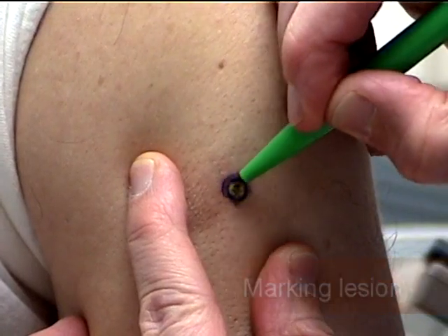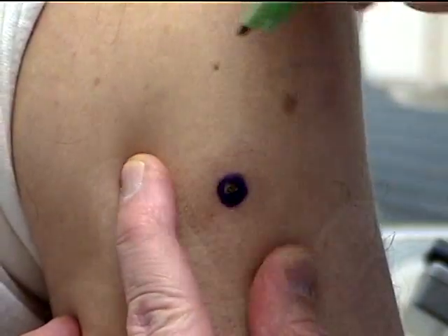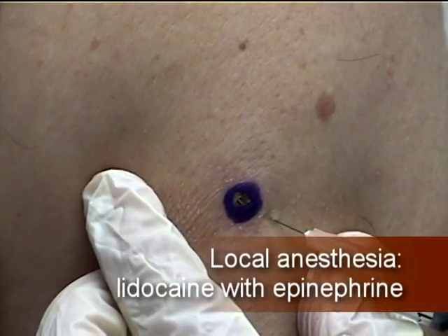Mark the lesion with a surgical marker to clearly delineate the extent of the superficial cancer. Infiltrate local anesthesia consisting of lidocaine with epinephrine under the lesion.